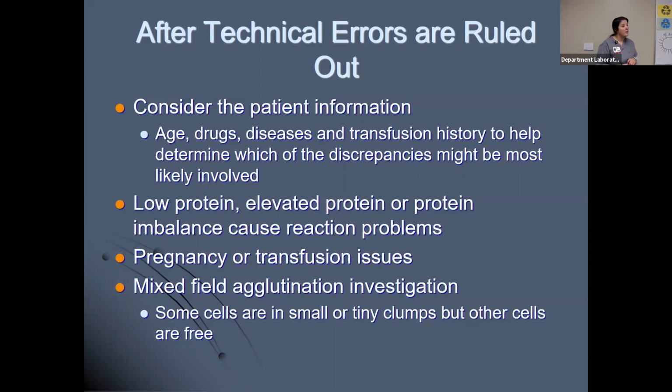Okay, we will talk a lot about rouleaux in blood bank. It interferes with our testing. The cells are going to come together and form that stack of coins. It could be interpreted as a false positive. So if you look at your test tube under the microscope, you will actually be able to see the stack of coins. Okay, that is rouleaux. We have an example, and we're going to talk about how blood bank can dissipate that rouleaux. Okay.